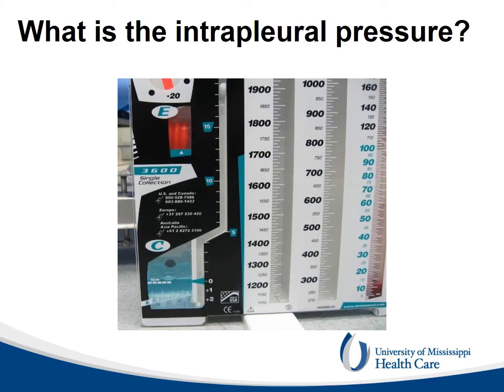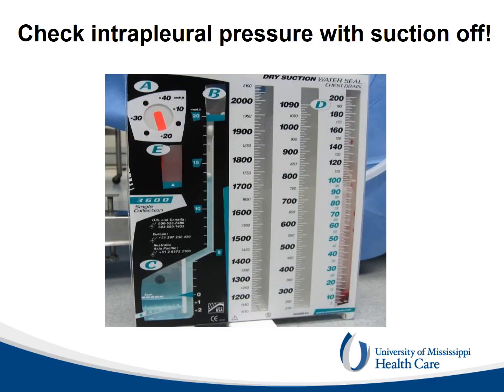Theoretically, the intrapleural pressure is +2 in the column of the pleural pressure indicator, minus 20 amount of suction in CDU, equal minus 18. However, if suction is disconnected, as indicated by the bellows non-expanded, it is possible to read a more precise intrapleural pressure, which in this case and in this moment is about minus 14. Therefore, a more precise intrapleural pressure is read off suction.